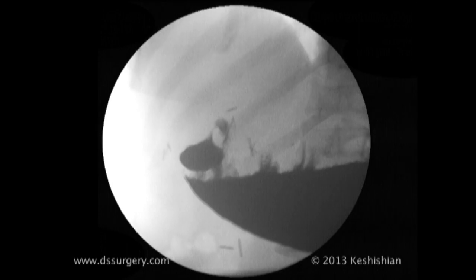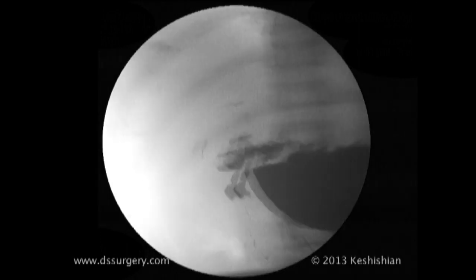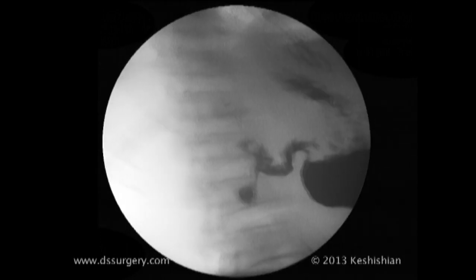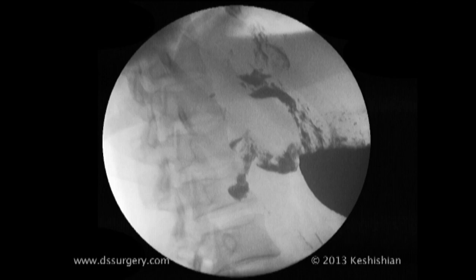As it travels down, the folds of the mucosa are noted. This is how abnormalities can be identified.